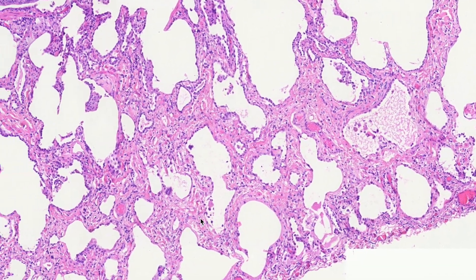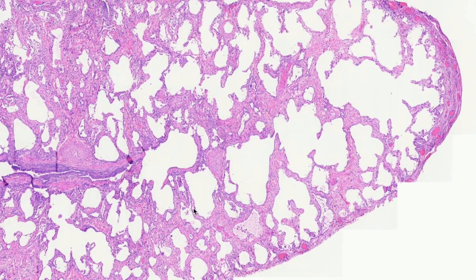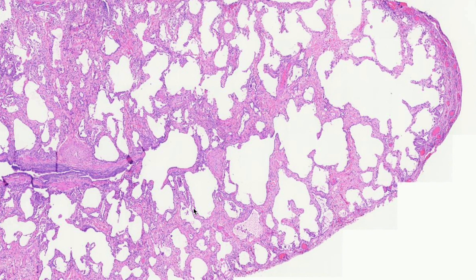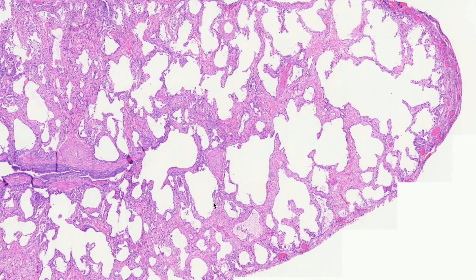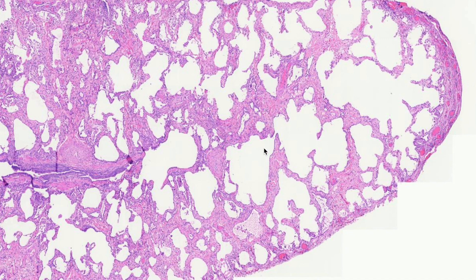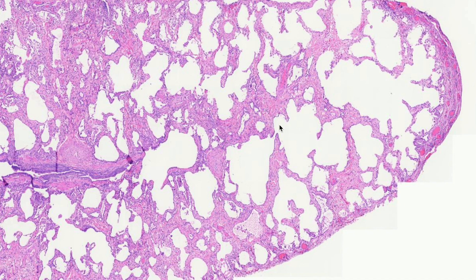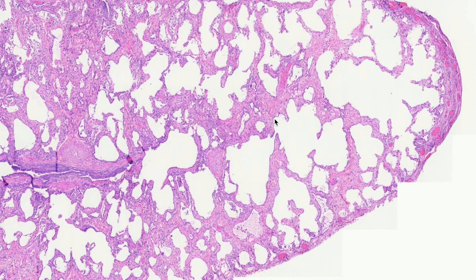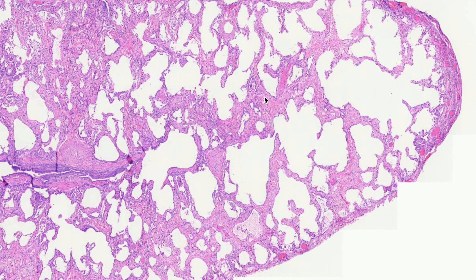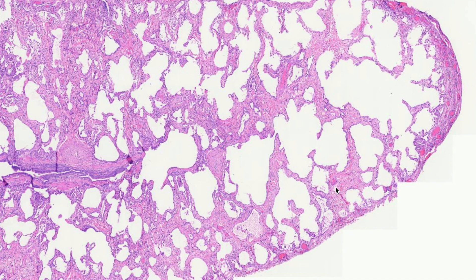Putting this together, this case is diagnostic of non-specific interstitial pneumonia. This is an important diagnosis for the pathologist to make because a subset of these patients will actually respond to steroids, in contrast to patients who have a usual interstitial pneumonia. To summarize: we have a very homogeneous process that is both uniform spatially, meaning it looks the same no matter where you go, as well as temporally, meaning uniform fibrosis without areas of normal lung and without areas of fibroblastic foci.